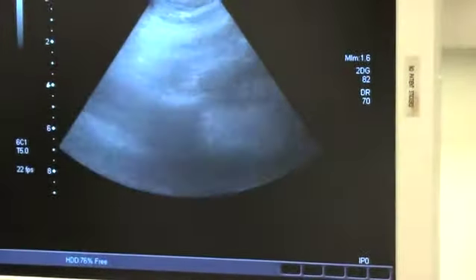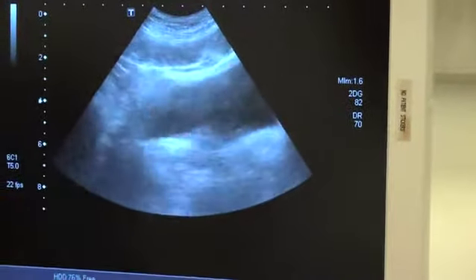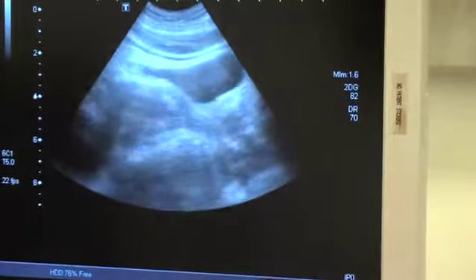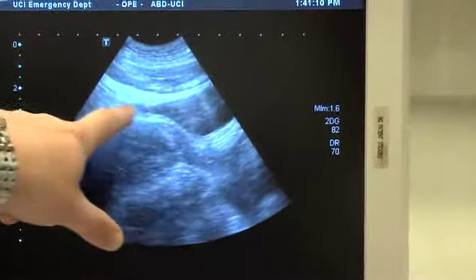So we scan through that view, and then we turn the probe with the indicator to the patient's head, and now I have a sagittal view. And I'm looking for fluid in the retrovesicular space and also in the pouch of Douglas back here. Let me point out the vaginal stripe and the uterus.